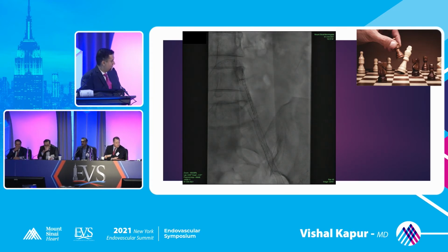Yeah. So now my covered stent got stripped because I was planning, like you said, to exclude my thrombus/fibrotic tissue. The only way to do that was to put a covered stent in. So I got a covered stent to exclude it, but because it's an 014 wire, stiffer section, ISR, and I pushed it through, and trust me, I was very gentle, no nudging, no shake movements like we do, nothing at all. It got stripped. The good thing is it got stripped right where the exclusion was.